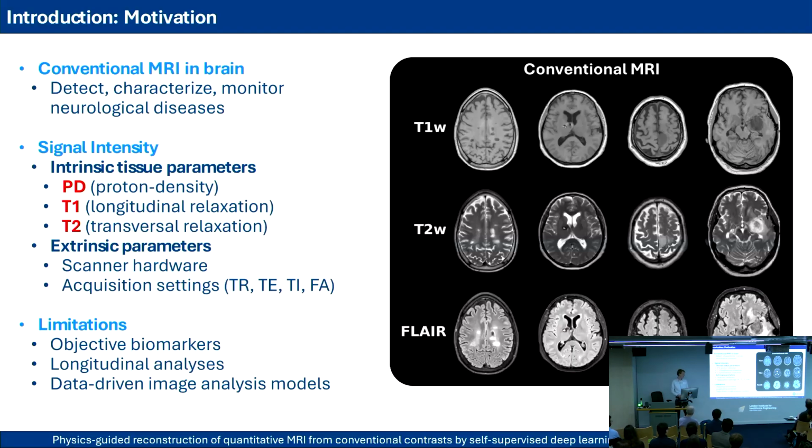And this leads to some limitations. So, for example, it hinders the development of objective biomarkers. It hinders longitudinal analysis, and also data-driven image analysis models are less generalizable than they potentially could be.